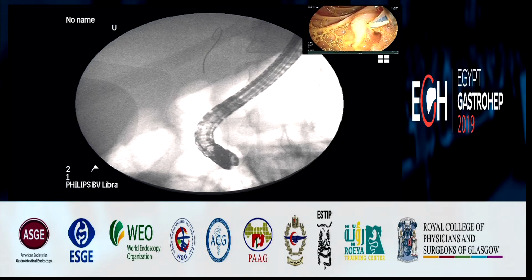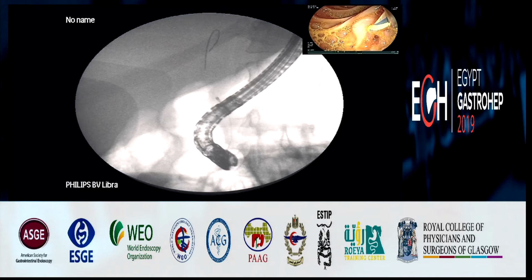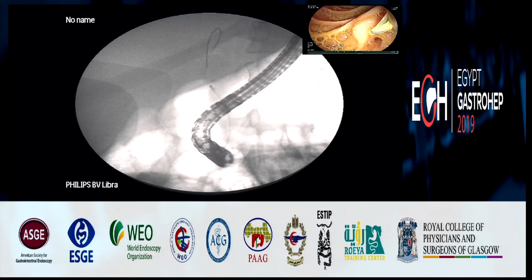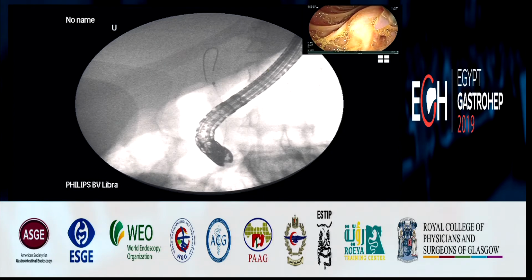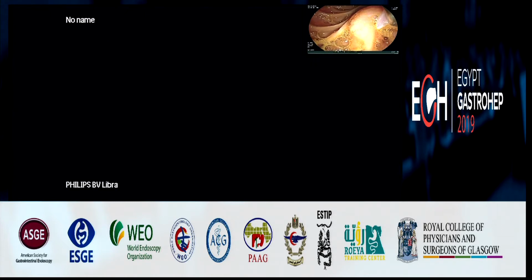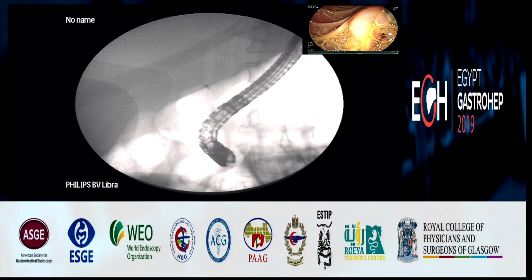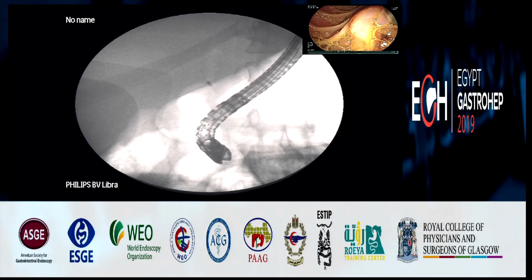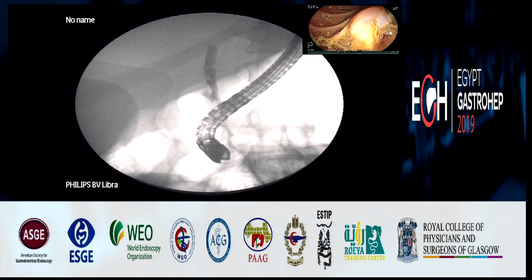What I'll do now is go a bit further up, and we'll inject. You can remove the guide wire, and we'll inject slowly from here, because the area of interest is in the hilum. So we will inject from there and then come down. Are we ready with the fluoro? Maybe it's better to see the fluoro directly. Okay, you can inject, Rania.